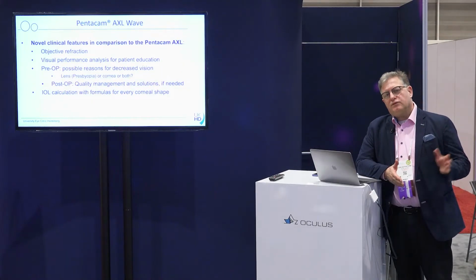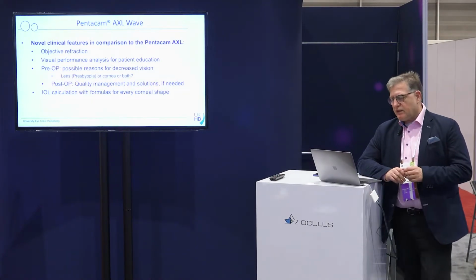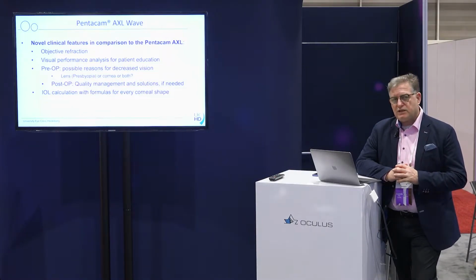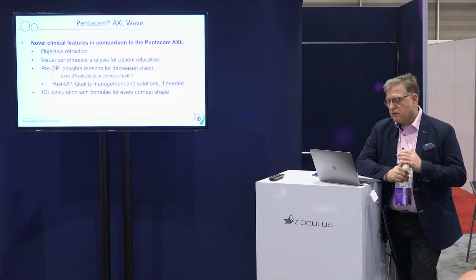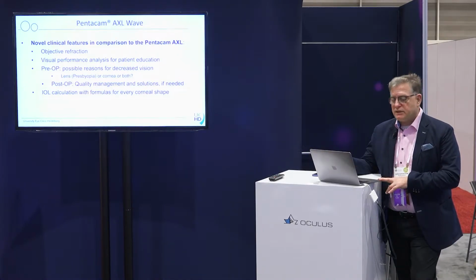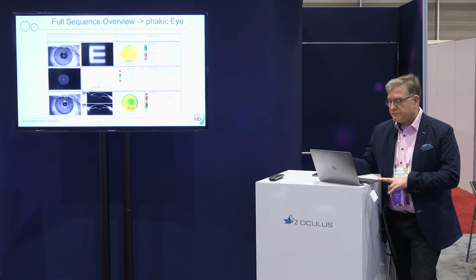So the new things from the Wave are an objective refraction and visual performance analysis. And then we can look at pre or post-op problems of the patient and offer a lot of solutions with one measurement. And as I just said, the IOL calculation formulas are really up to date now and very interesting.